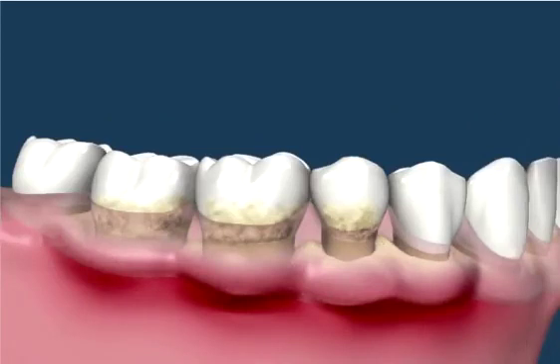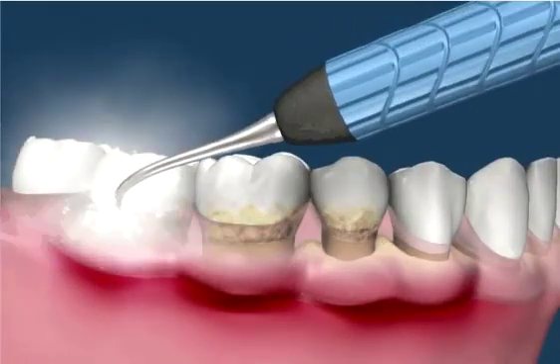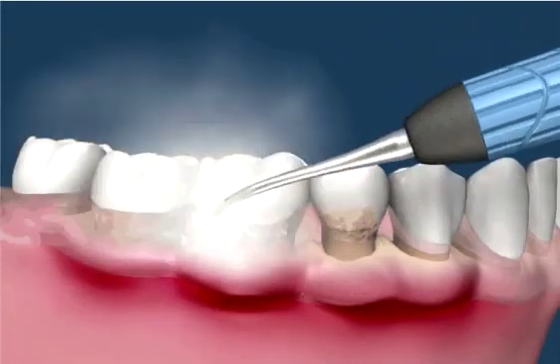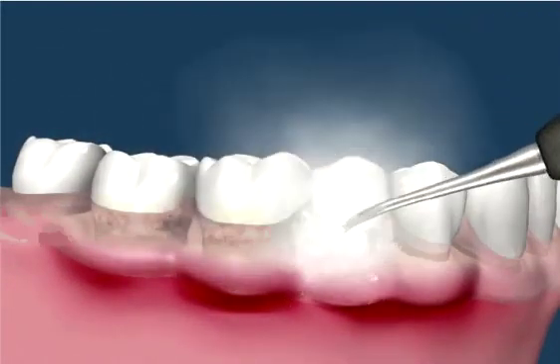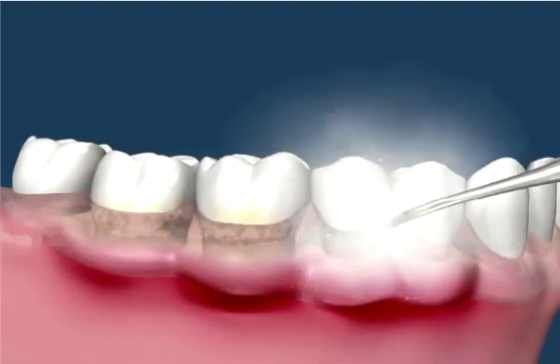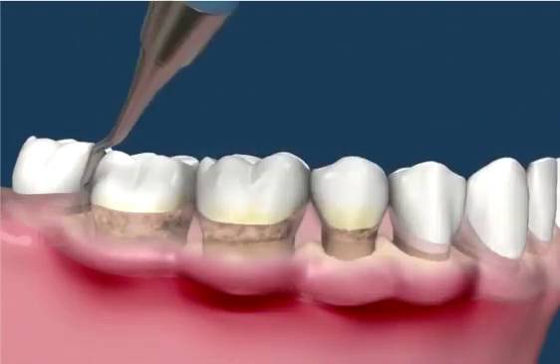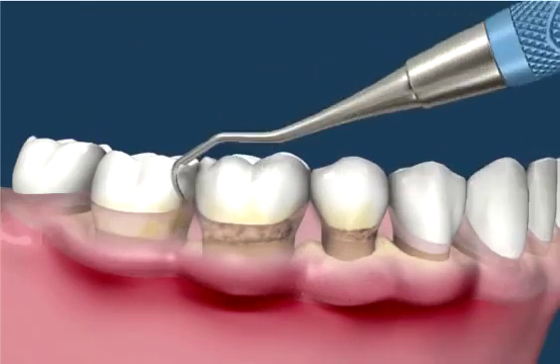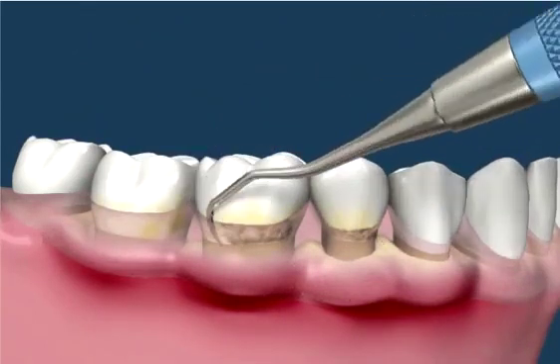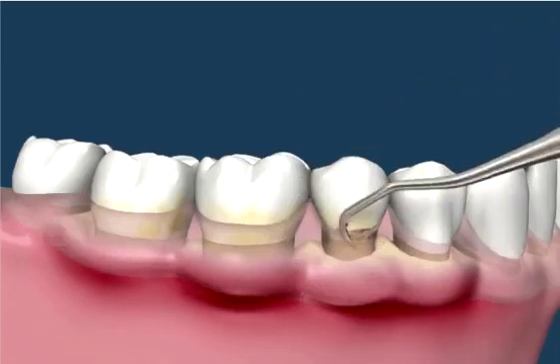The dentist or hygienist can use ultrasonic instruments that vibrate, together with a jet of water, to dislodge the calculus from the teeth. The fine amounts of calculus left behind, especially under the gums, may require hand scaling instruments to be removed. There are many specialized scaling instruments that are able to remove the calculus from all tooth areas.